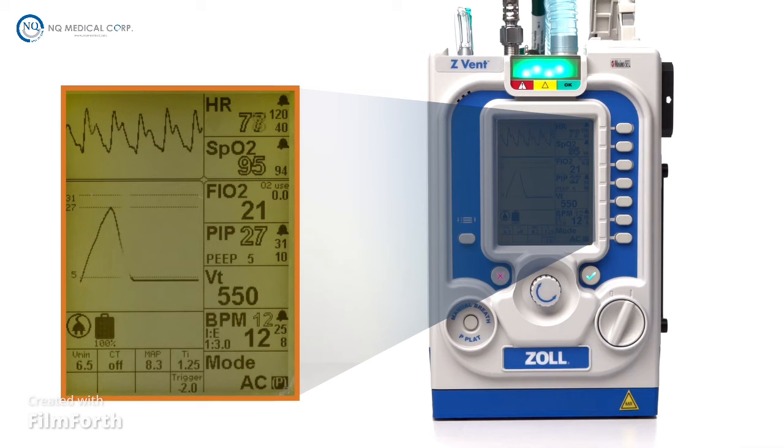In assist control mode, the patient receives either controlled or assisted breaths. When the patient triggers an assisted breath, they receive a breath based on either the volume or pressure target currently set. This is displayed as either ACV, indicating volume-targeted breathing mode, or ACP, indicating pressure-targeted breathing mode.